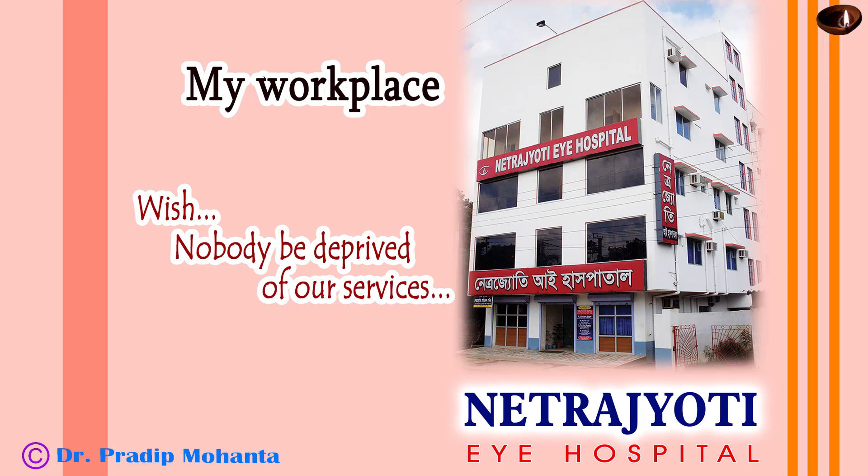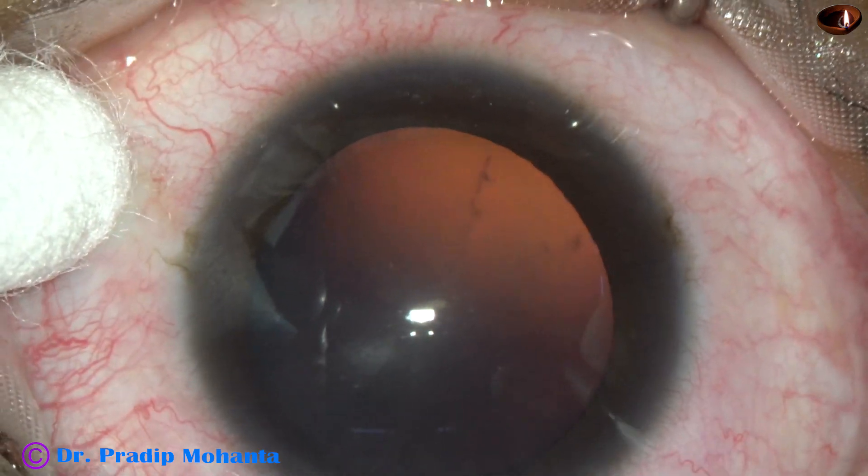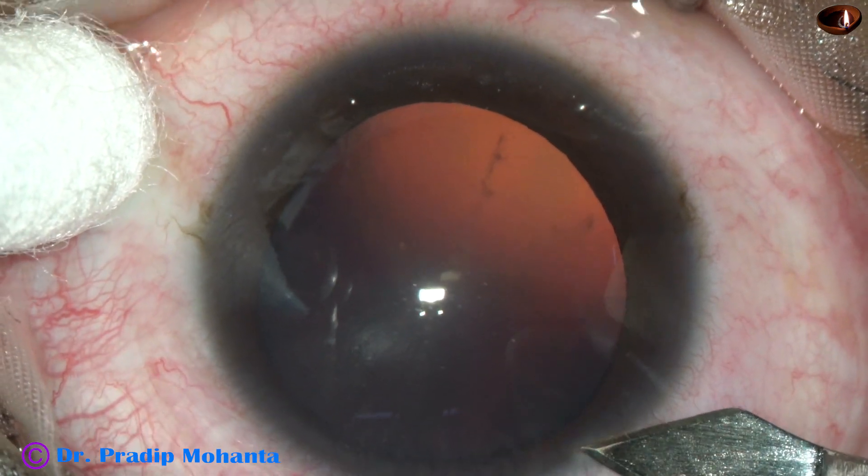Friends, welcome to my workplace at Ranagh Heart, West Bengal, India. This is a very soft cataract. You can see radial lines in the lens mass. We can call this a cycle spoke cataract.